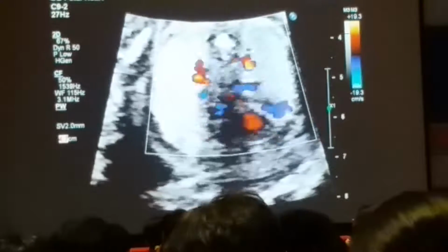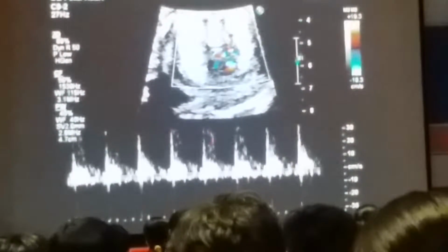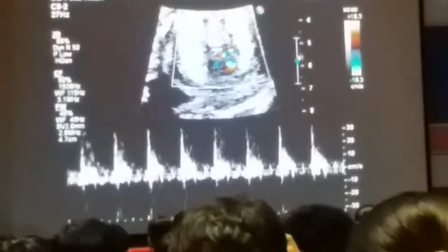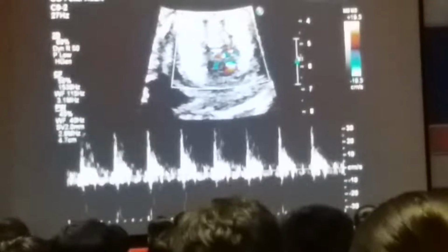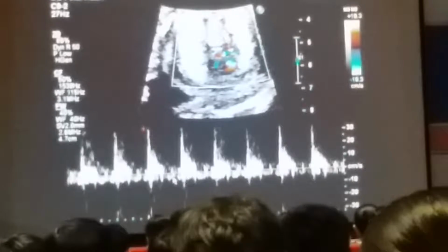That there is a signal coming towards us. That's the pulmonary artery. You see that very early signal here. You see how this comes up quickly and then falls down because of the elevated pulmonary vascular resistance. On the other side of this line is the pulmonary vein, you see, with an E and an A.